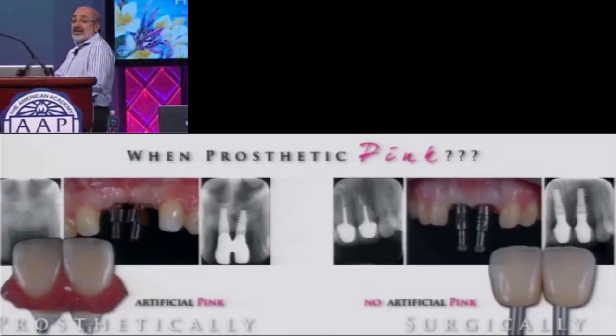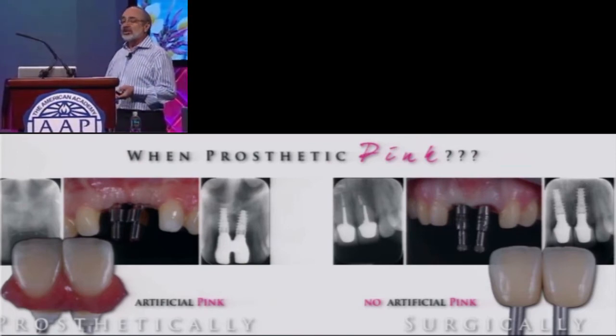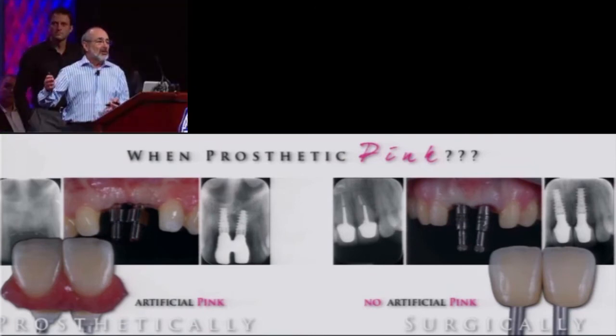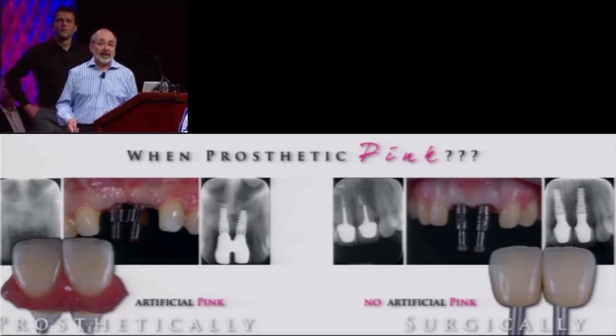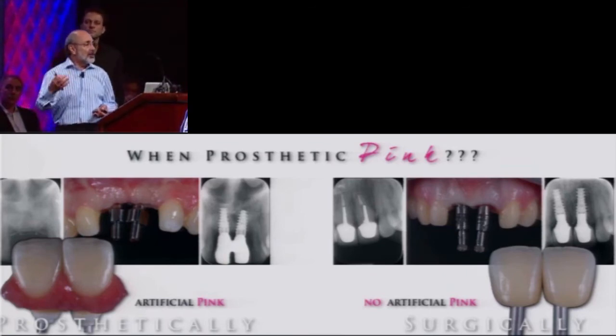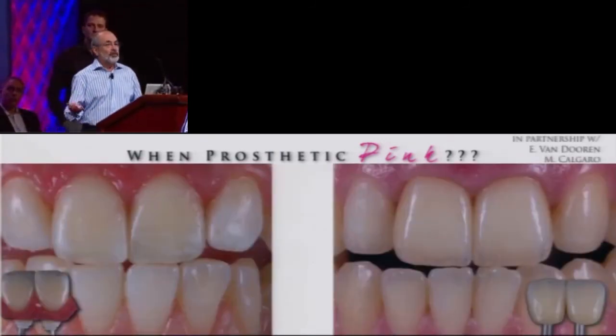So on any given case, just 2 centrals, this is our ongoing dilemma. Do we go ahead and try and augment this tissue, accepting that if we have adjacent implants, there are limitations, not only what we can do surgically, but biologically? How high can we bring this papilla from the underlying bone? And is there a difference when you have implant to implant relationships as opposed to implant to pontic or implant to adjacent root, as you'll see? And then do we actually have the option in any given stage, depending on the patient's limitations as well, on when we should actually contemplate doing prosthetics in this.